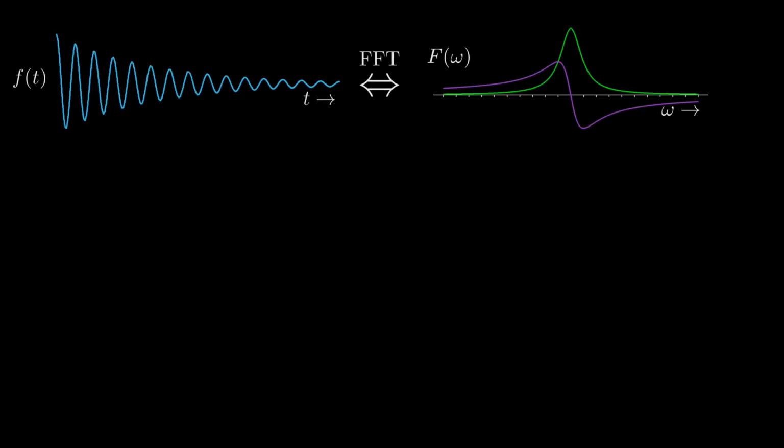One quick note about variable conventions. So far throughout our discussion, I've used t as our independent variable for f, and omega as our Fourier space variable for frequency. The implication is that t represents time, so a frequency omega must be in inverse units of time. For instance, if t is in seconds, omega would be radians per second, or hertz if you divide by 2 pi. This is simply standard convention in papers and textbooks. Omega represents temporal frequencies in this context.